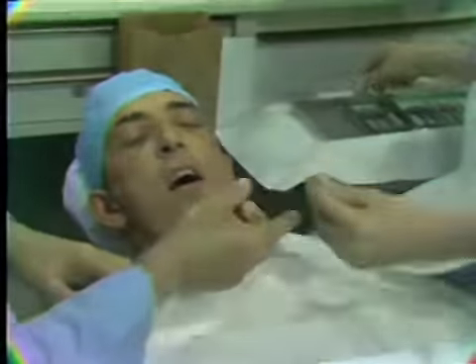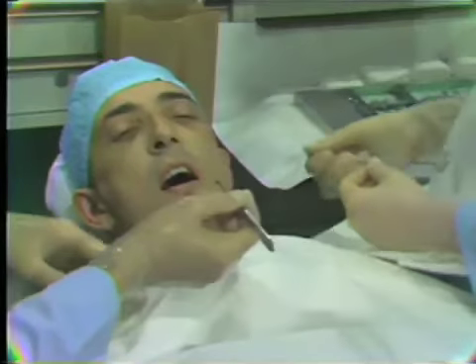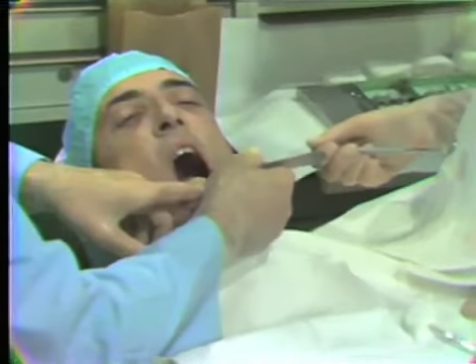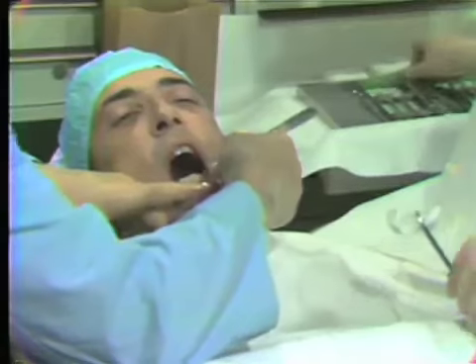With the scalpel, we usually move slightly back away from the patient's chin area so that we're not in close contact with the patient's face, and we can move then directly into the mouth from that position. Aspiration, please.